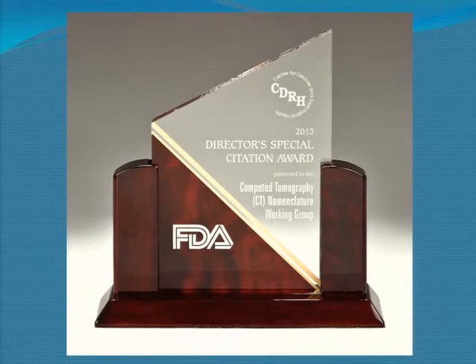And then we thought about it some more. At that particular time, we were still printing to film, and one of the things you have to be neurotically compulsive about if you print to film is the display field of view. Because if you're going to use a ruler on that thing, your display field of view has to be totally constant and really well controlled, or the tumor size will change just depending on your mag factor.